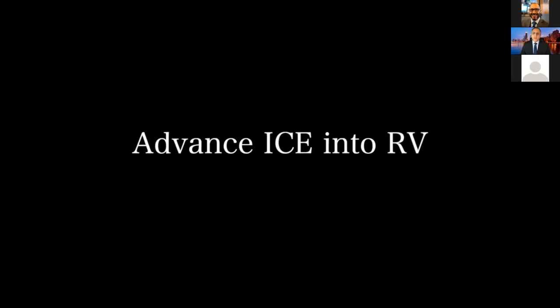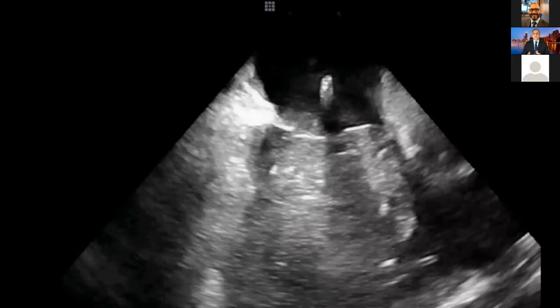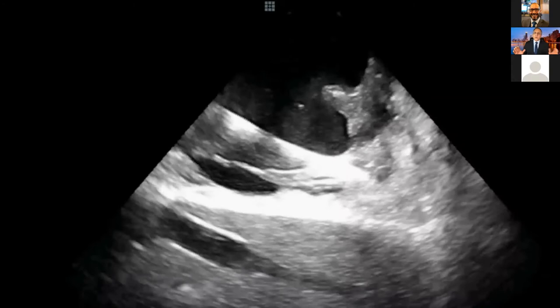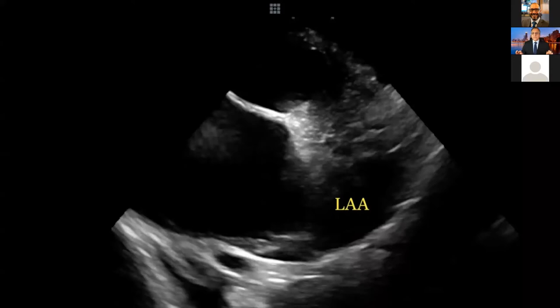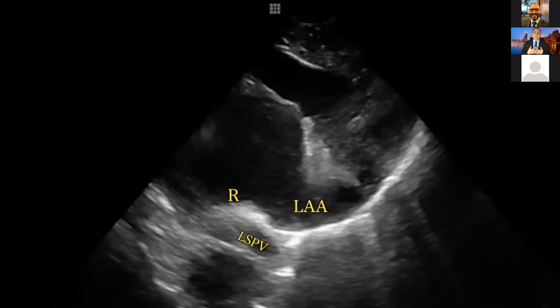I want to talk about visualizing the left atrial appendage because we want to avoid TEE, especially in this era of COVID. If you go to the right ventricle with anterior tilt, then do a clockwise rotation — not too much — you'll see the left ventricle. A little bit more clockwise rotation, and you're going to see the left atrial appendage. A little bit more clockwise rotation and you'll see RVOT and pulmonary artery — you don't want to go that far. I do not suggest this view to rule out thrombus — it's suboptimal.